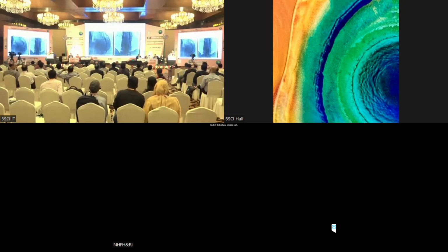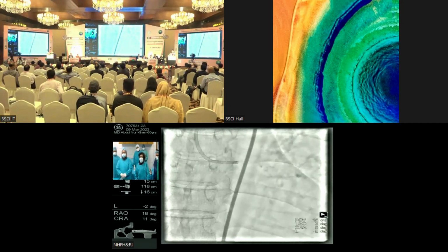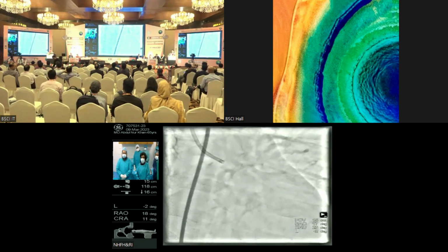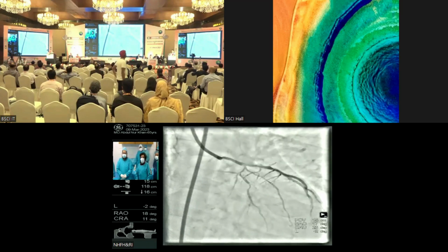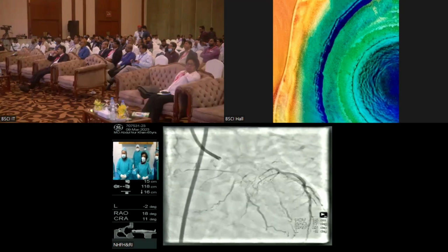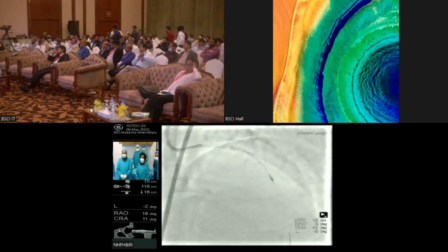As you can see, there was a significant amount of calcium visible angiographically in the LAD and the left main, so we were a bit concerned about the extent of the calcium. This is what we did up till now. The disease starts from the ostia of the left main, and we saw pressure damping as soon as our catheter sat there, so we kept our catheter disengaged. We then proceeded to wire our vessel, and we had a look with the IVUS.